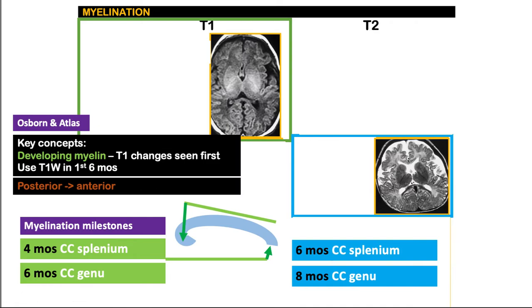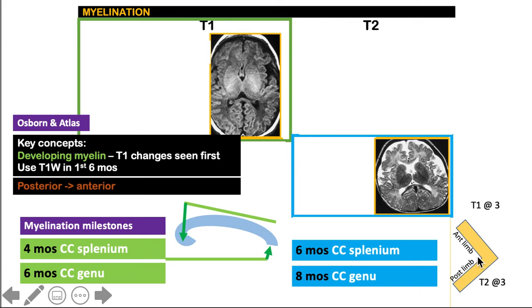Now, for the internal capsule, we have to remember two numbers: three and eleven. At birth, the posterior limb already has a T1 hyper-intense signal. Following our rule — T1 changes first, T2 later — the T2 changes come at three months. At three months, you also see T1 hyper-intense changes on the anterior limb, consistent with the posterior-to-anterior rule. The T2 changes in the anterior limb then come at eleven months, which corresponds to when the baby is starting to cruise and walk.